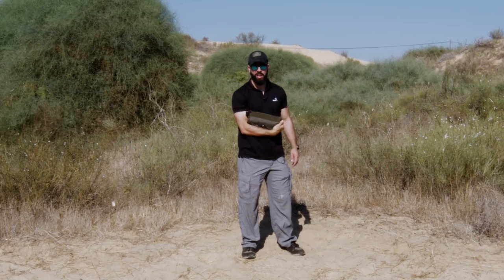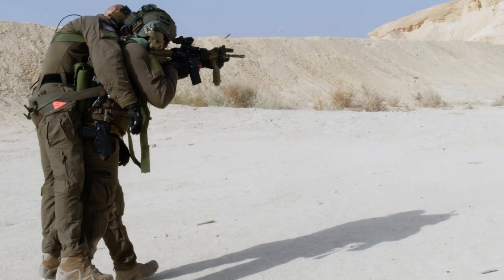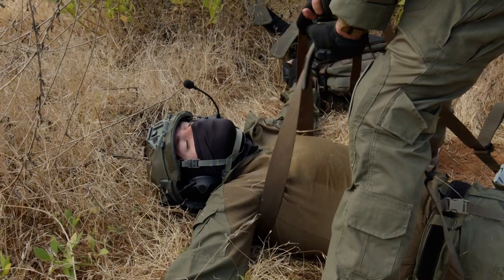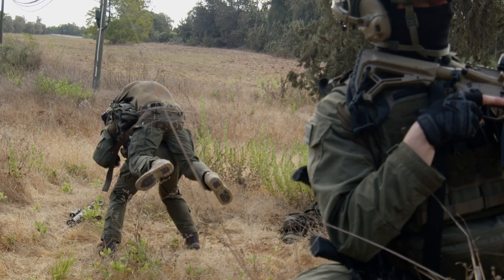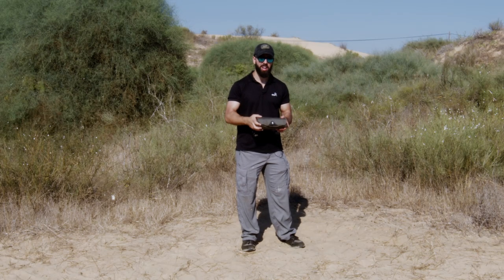This is the buddy strap. It's a one-man rescue device that lets someone carry someone on their back and still retain use of their weapon. Unlike a fireman's carry, this carries someone as a backpack. It allows you to take an injured person, put this harness on them, and then wear them using backpack straps. We're going to demonstrate this today for standing position and prone position.